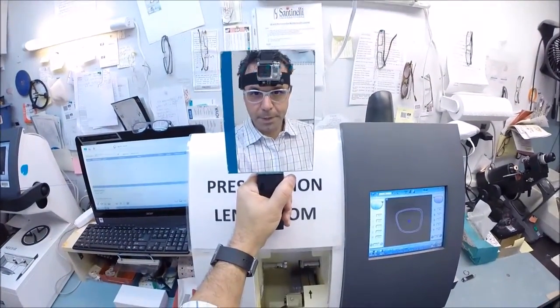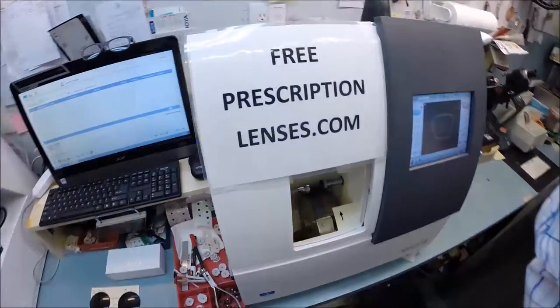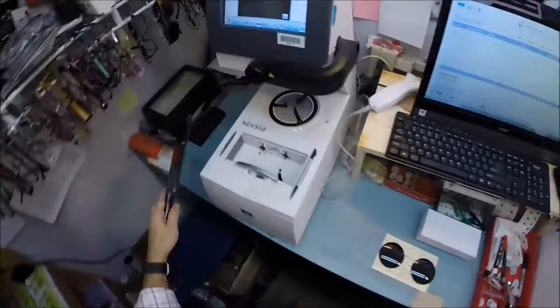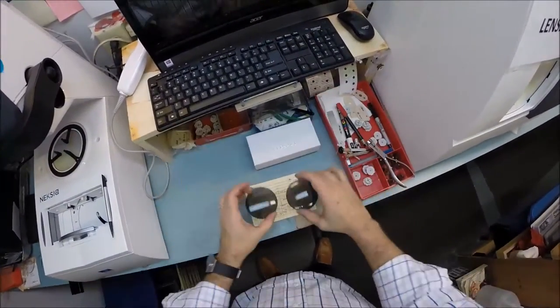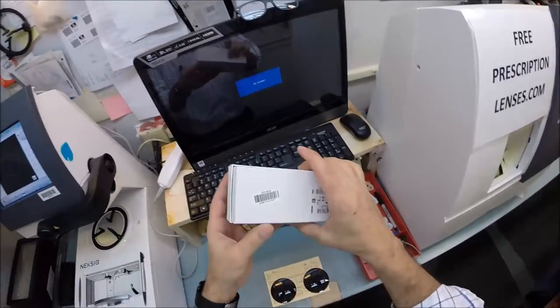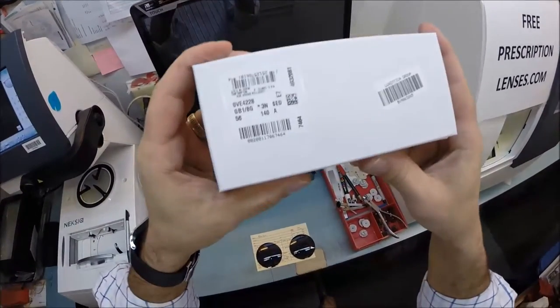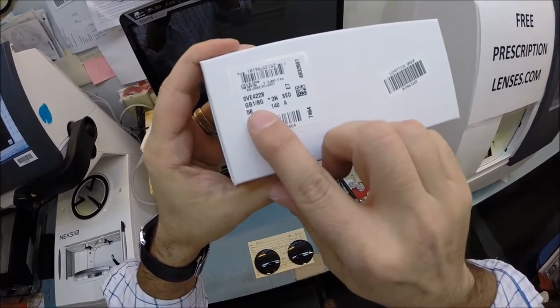Hey Sharon in Burlington, Matthew here with freeprescriptionlenses.com. With the help of my GoPro camera, I'm going to show you how I cut prescription polarized lenses for your Versace, model number 4228 in color GB1, which is the classic black and gold in the 56 eye size.